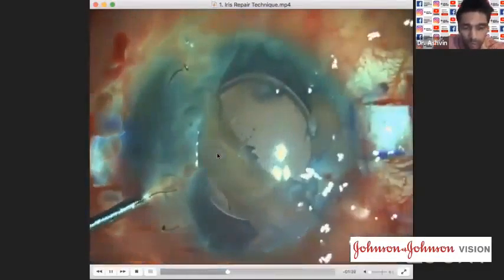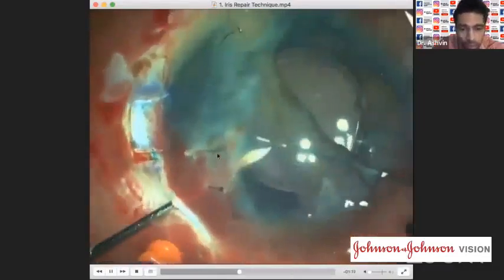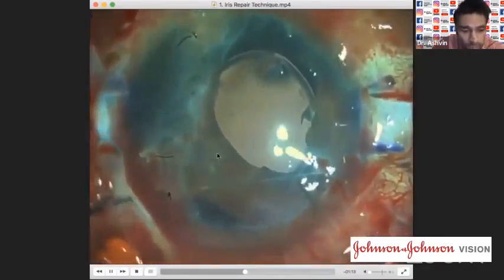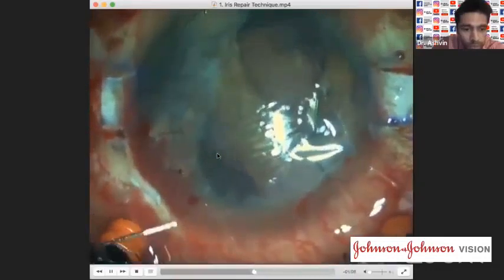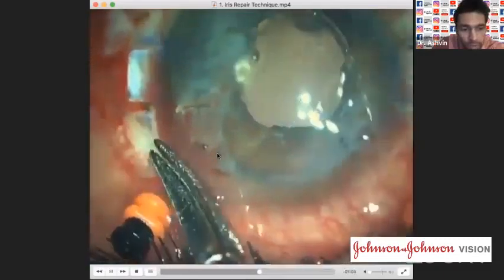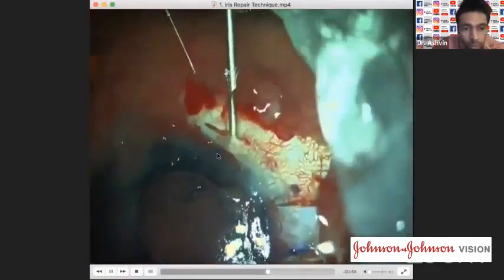Now, as Dr. Abhay said very nicely, you shouldn't try it if you cannot manage it. But in this case, the patient was a very non-affording one, and I didn't have a choice but to go ahead and try at least and repair whatever I could. Hence, doing a hangback technique was the first option. So hangback technique, double arm Prolene suture taken, making a scleral ridge, going on one side and pulling it apart, ensuring that I'm securing that knot into the scleral ridge. Making a second ridge, because that counter traction will help me do a pupilloplasty at the end.